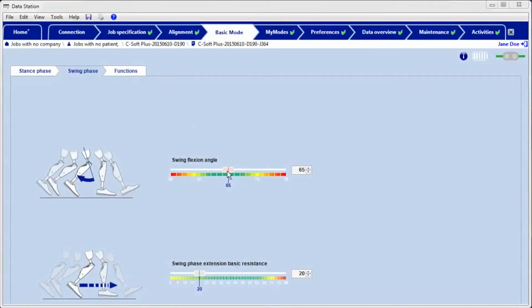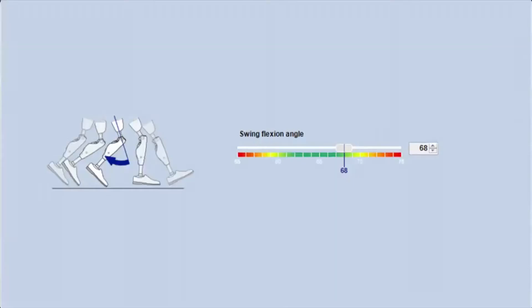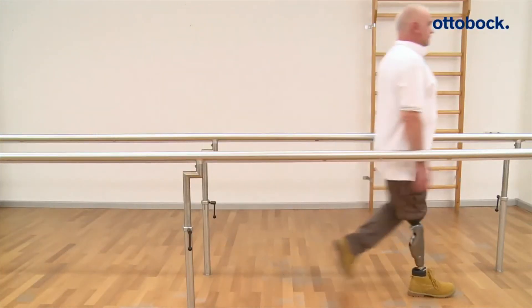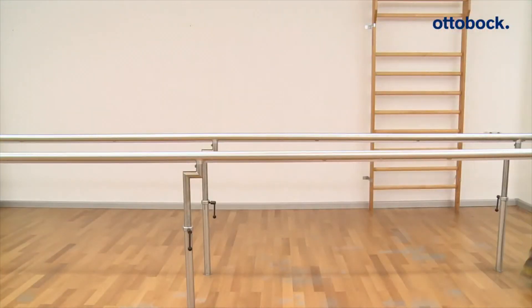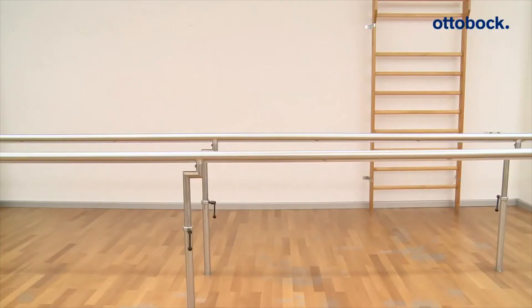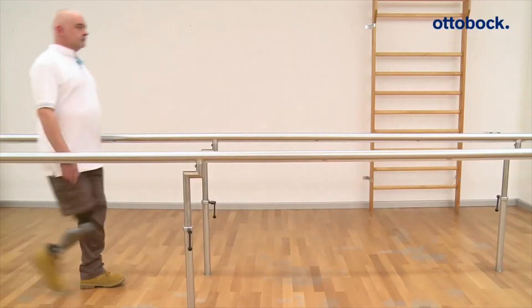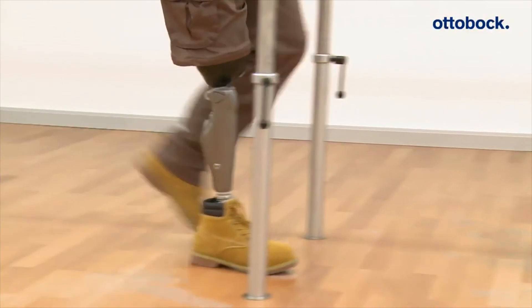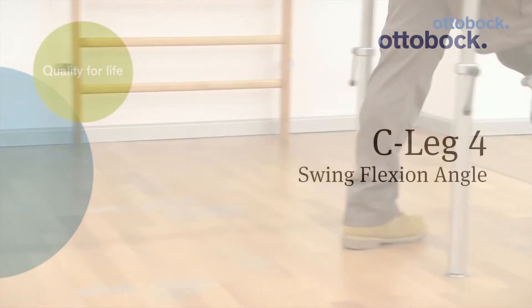If the value is significantly set too high for the patient, the prosthetic leg comes too late into knee extension. The patient has to wait for the prosthesis to come forward and is limited in walking speed. The gait is strongly asymmetric. If the value is appropriate for the patient, a symmetric pendulum behavior is visible with adequate ground clearance.